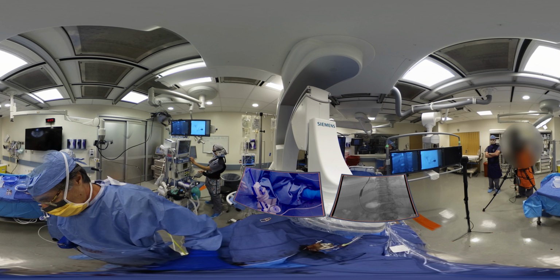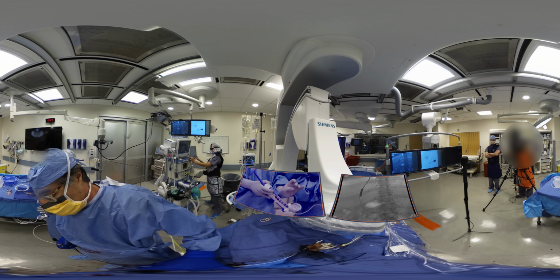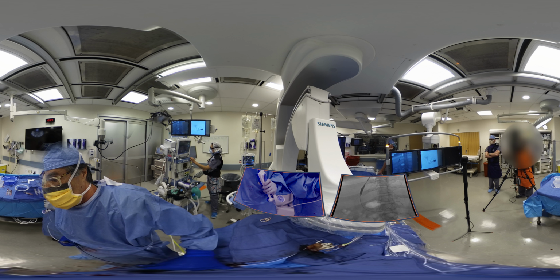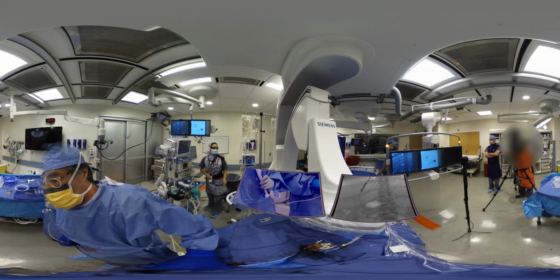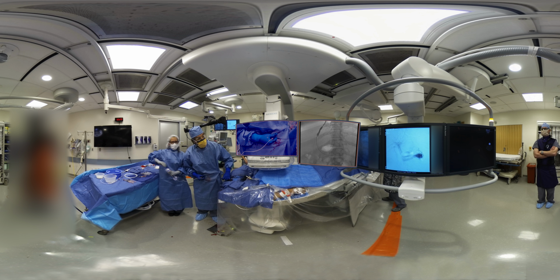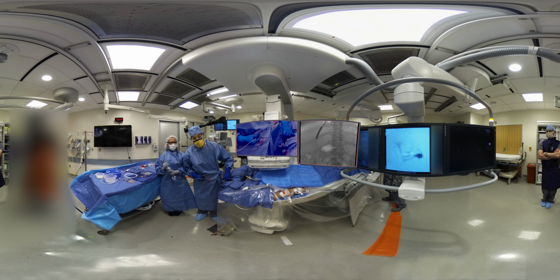In the meanwhile, I'm going to bring the sheath back a little bit more, and we're going to bring the balloon back more to do the hepatic vein exit site, which is there. A lesser impression, go ahead and dilate that. And that's the hepatic vein exit site. So it's really a rather short track.